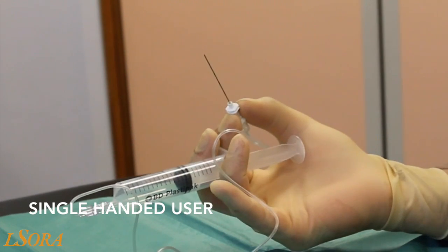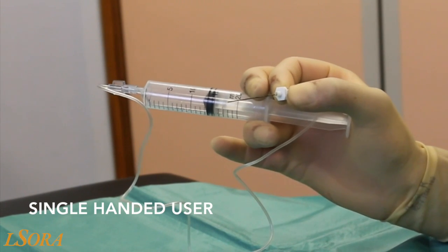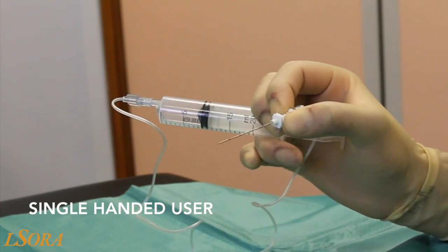With this technique, pressure from the thenar eminence on the plunger allows injection. However, there is no ability to aspirate. This is offset by increased accuracy of needle manipulation between the thumb and index finger.